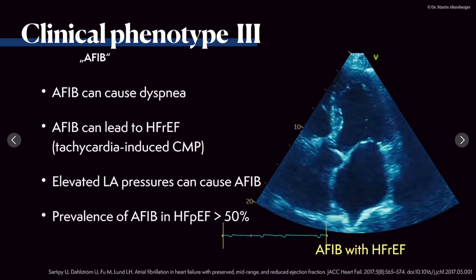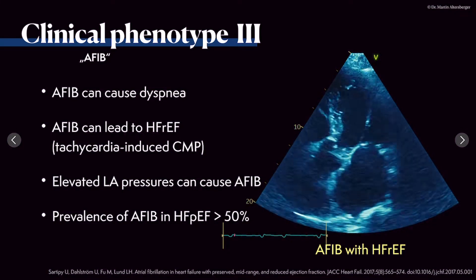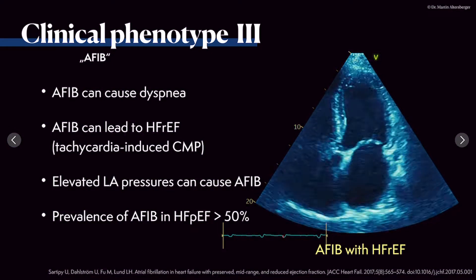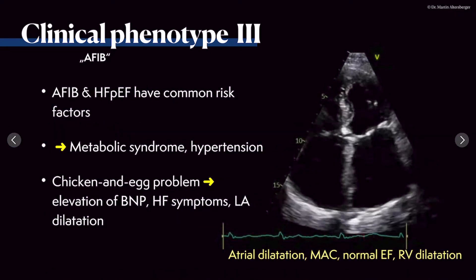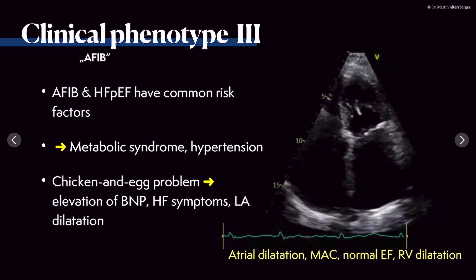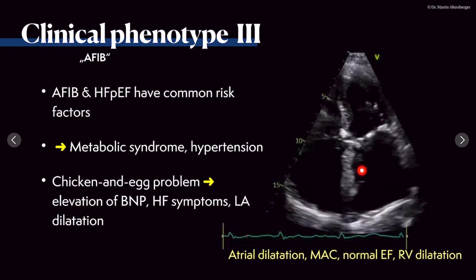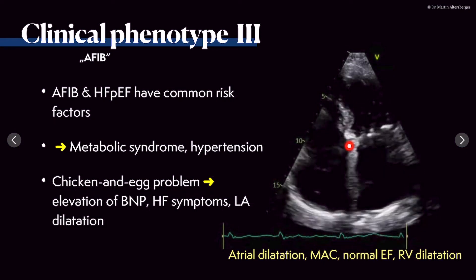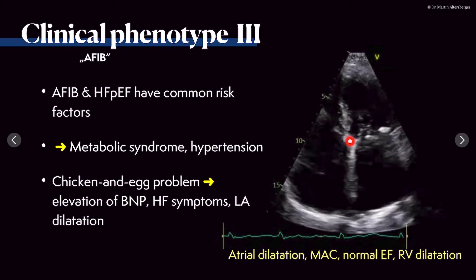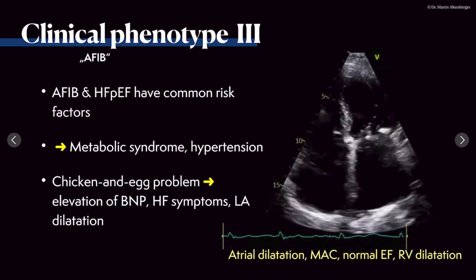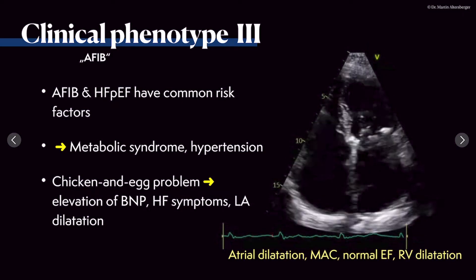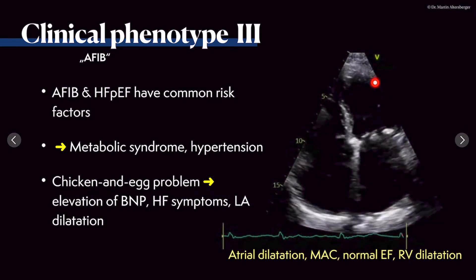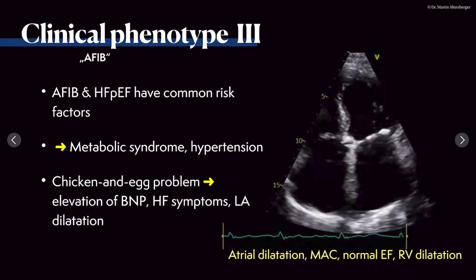It's important to note that in heart failure with preserved ejection fraction, the prevalence of atrial fibrillation is fairly high. In this patient who also has atrial fibrillation, we do see the enlarged right and left atrium, the calcified valves, even calcifications at the beginning of the LVOT — so also the aortic valve is calcified — but left ventricular function in this case seems preserved, in the range of 50% in this apical four-chamber view.